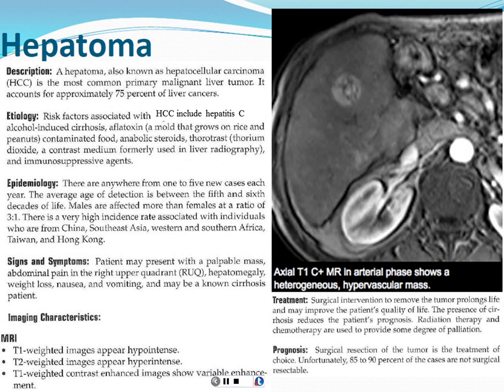And I'm not sure if you're familiar with the EOVIST contrast, if you've seen that used for liver imaging, that's become a really helpful tool in sorting out cases of hepatoma. It's also been useful in picking up very small liver metastases that were not always detected by CT. It just gives us an extra piece to the puzzle, because every MRI has many, many sequences. It's like a puzzle, and that just helps us put it together.